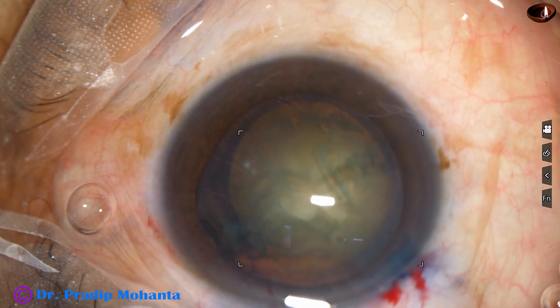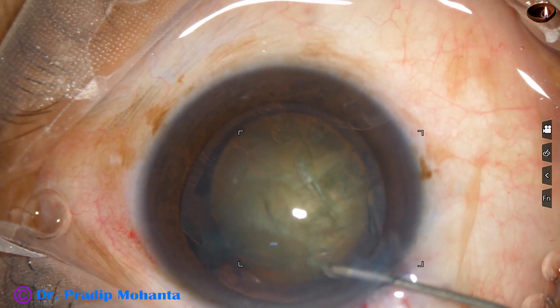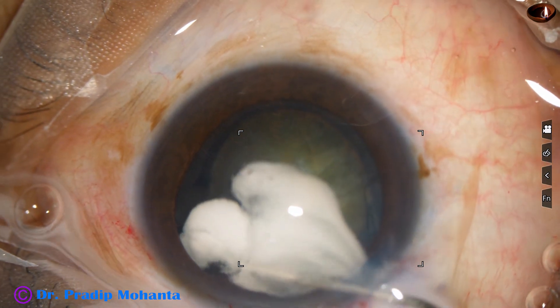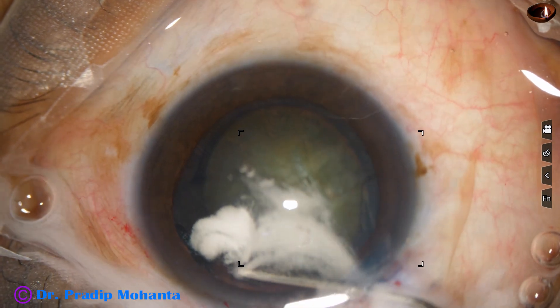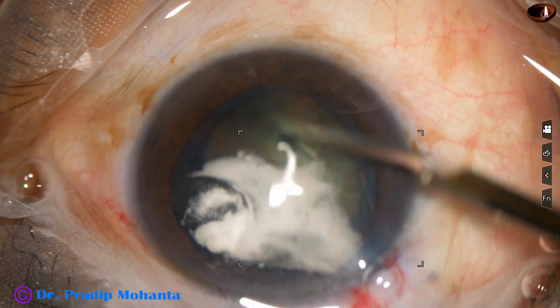You can see a red glow through the zonula. So there is zonular dehiscence. I use Kenalog to see if I can stain the vitreous strands.